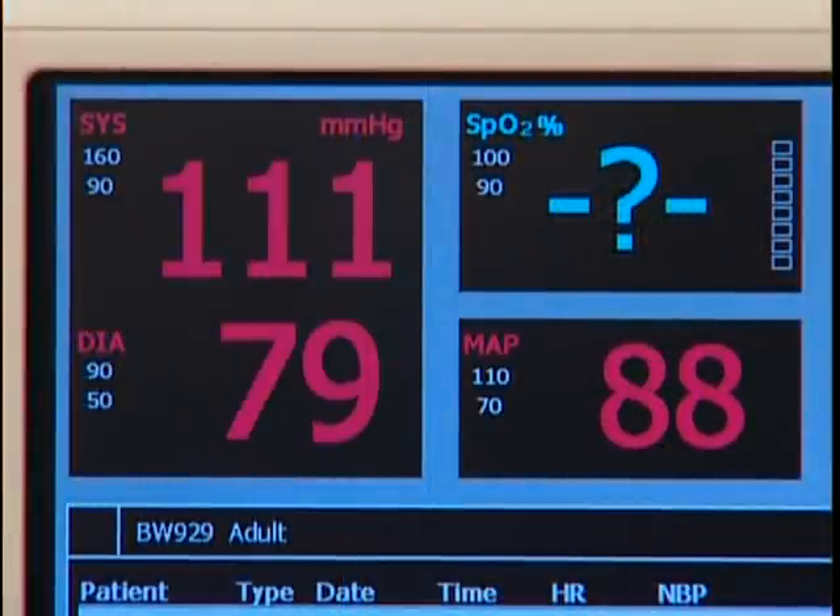Following deflation, the NBP measurement is displayed on the screen, including systolic, diastolic, and mean arterial pressure.